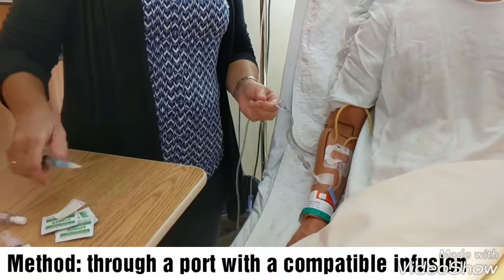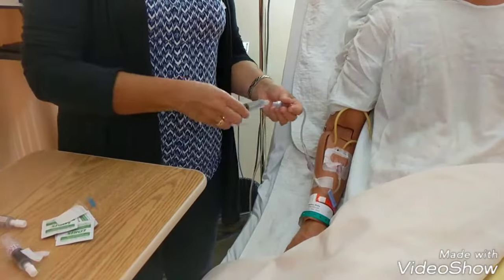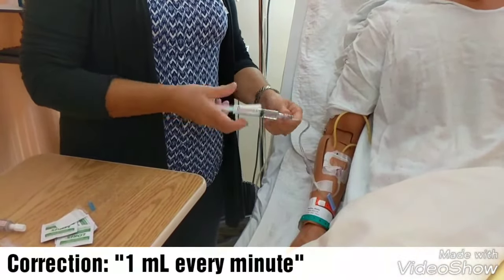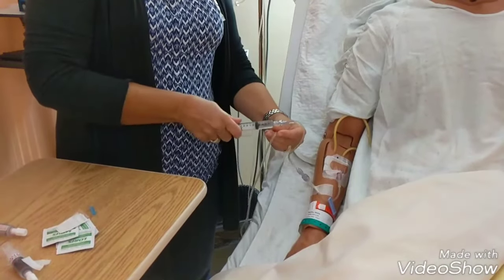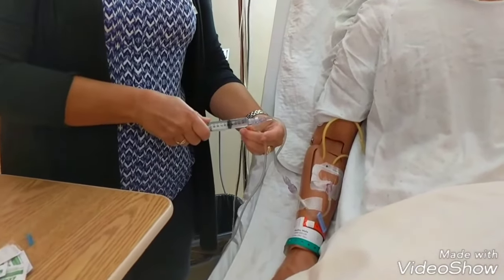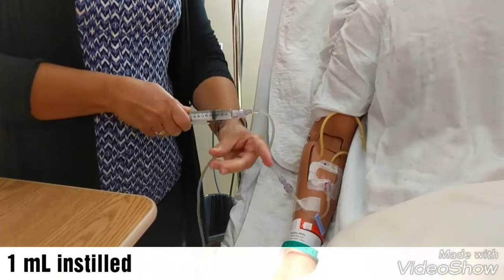I've got my syringe of morphine. I'm going to give 0.1ml every minute for five minutes. I'll put it in here and I'm going to have my watch with the minute hand ready. I'm going to pinch my tubing, instill 0.1 of a mil, and then unclamp my tubing.